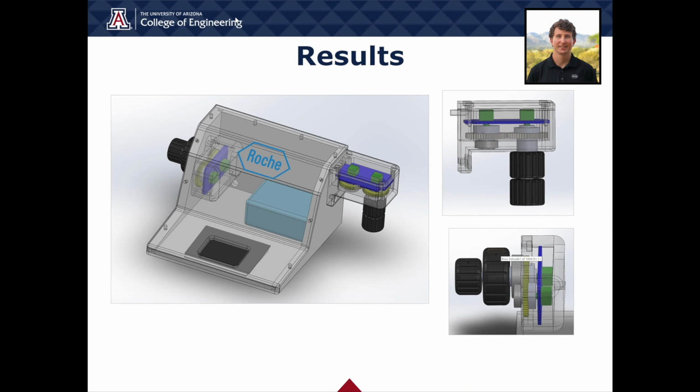The trackpad is set at 5 degrees offset towards the user in order to reduce user fatigue. The knobs are stacked, which is commonly found on both panning and magnification knobs on microscopes, which is achieved by using a gear train which allows for 2 different rotary encoders to be driven.